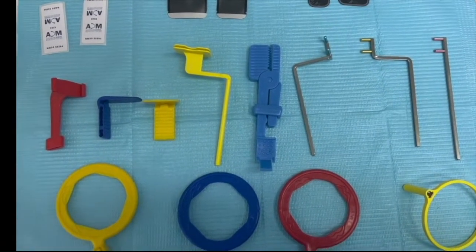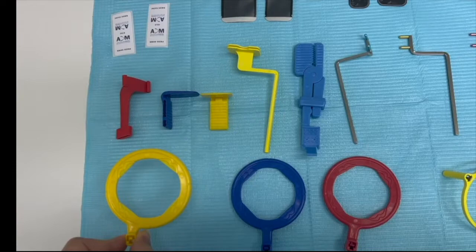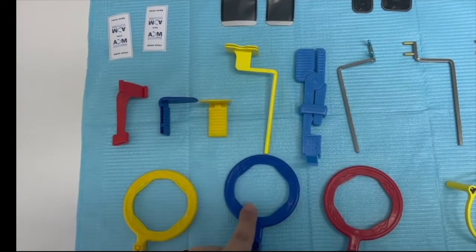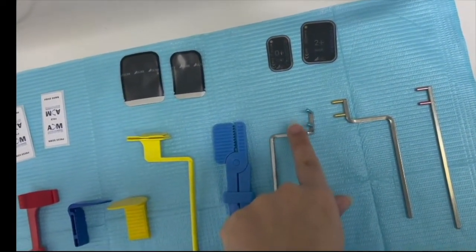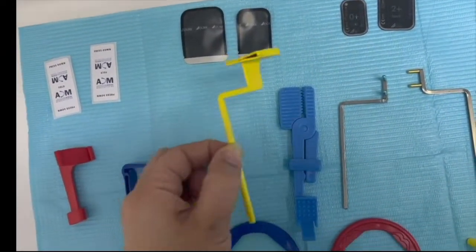First you're going to find these sets of holders. You have the ring system and the curve system. In the ring system, the yellow one — which I'm holding right now — is for the posterior PA. The blue one is used for the anterior PA, and the red one is for bite wings, along with their corresponding arms each with the same color and film holders.